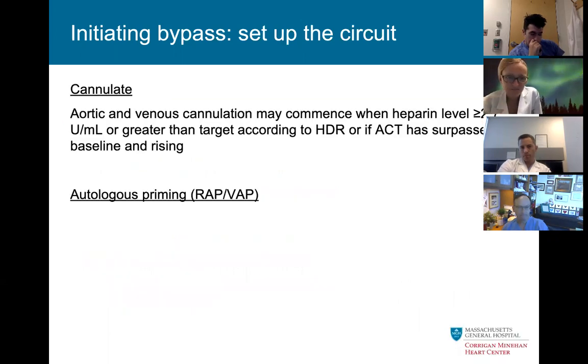Once we've given the heparin, the next step is cannulation. We usually commence that once the heparin level is more than 2.7, or if the ACT has surpassed the baseline and is rising. Question for Travis Hull: what does RAP stand for, and VAP?